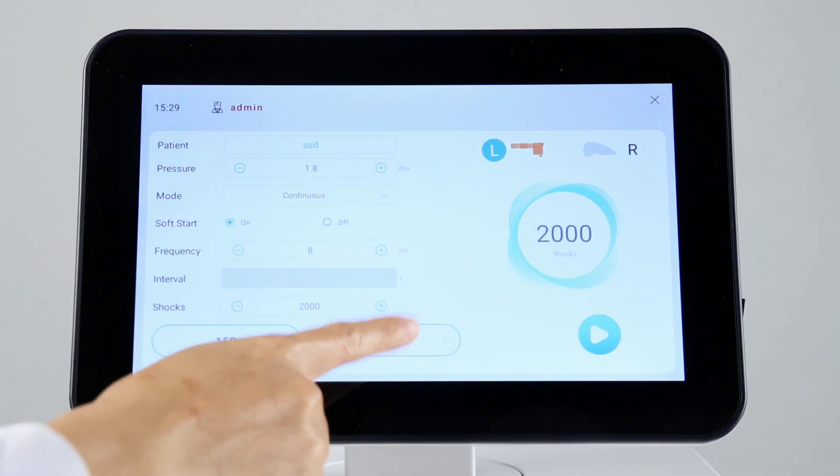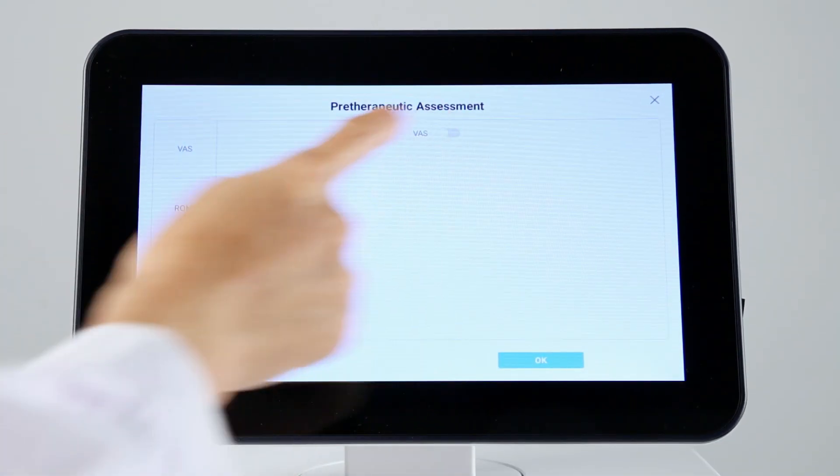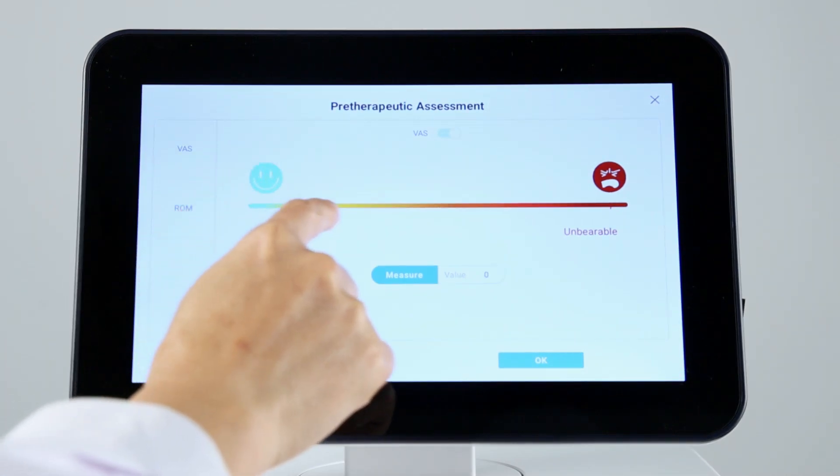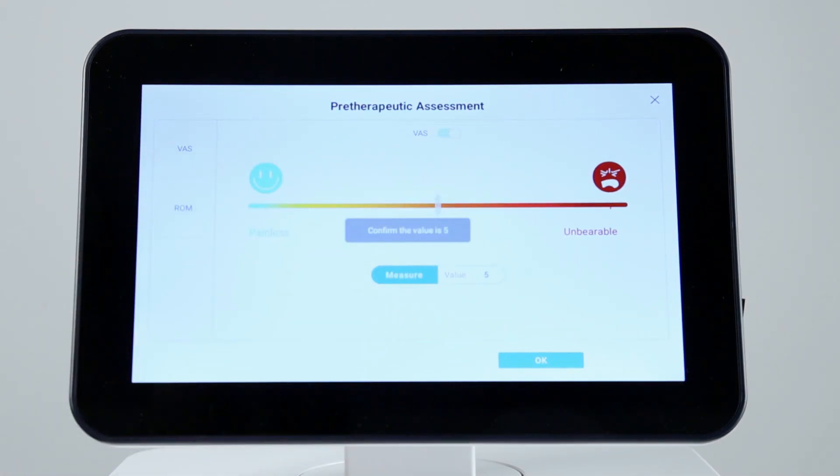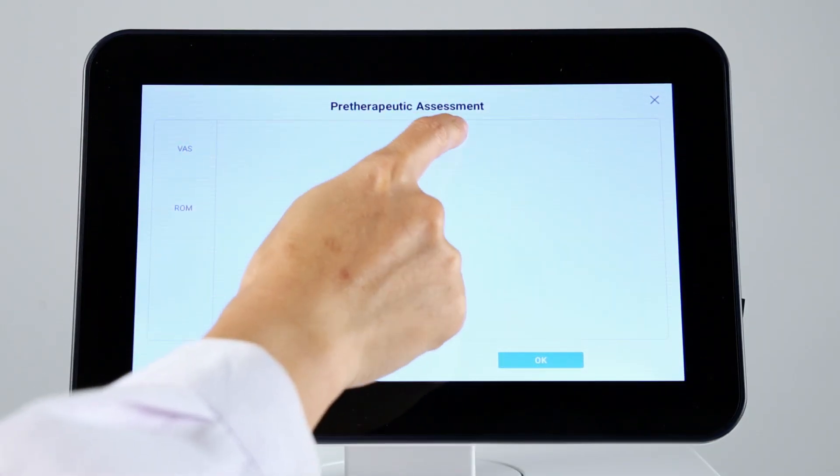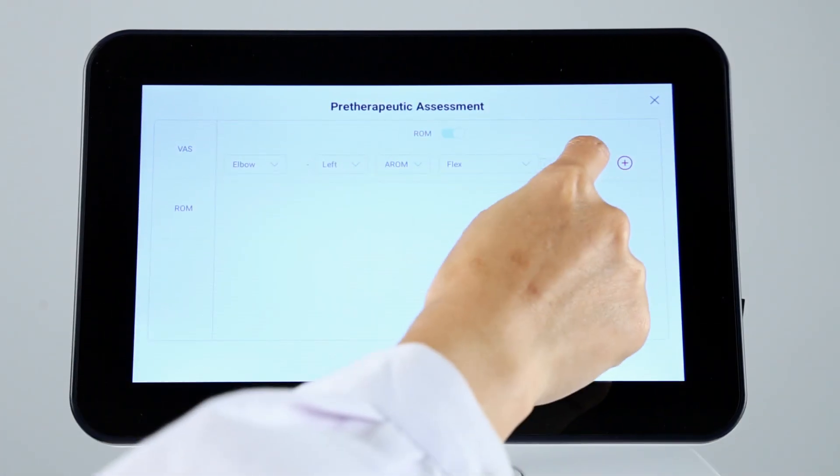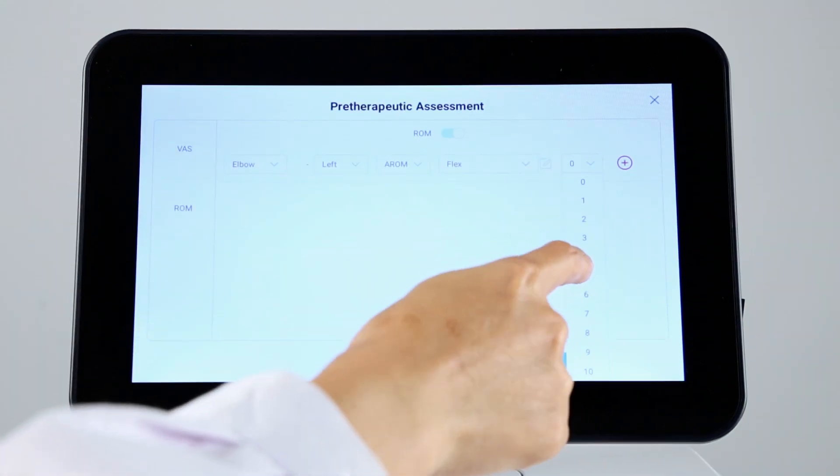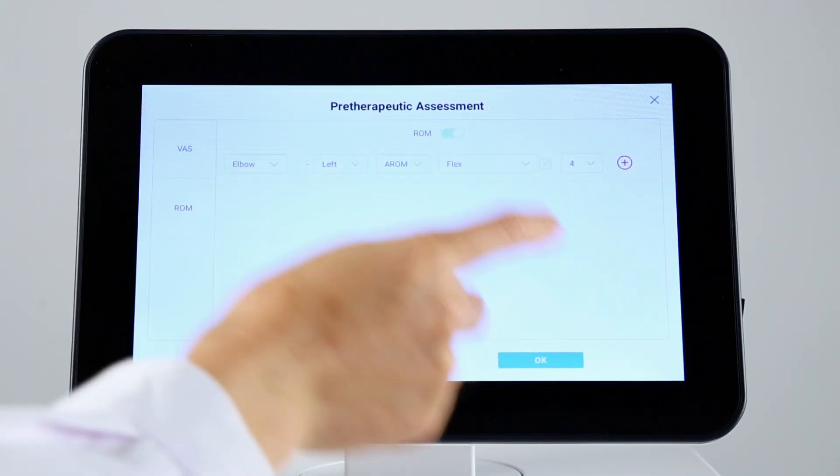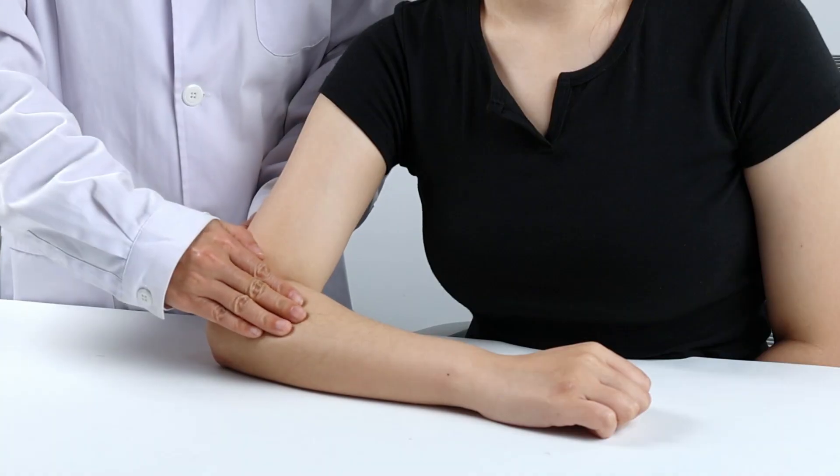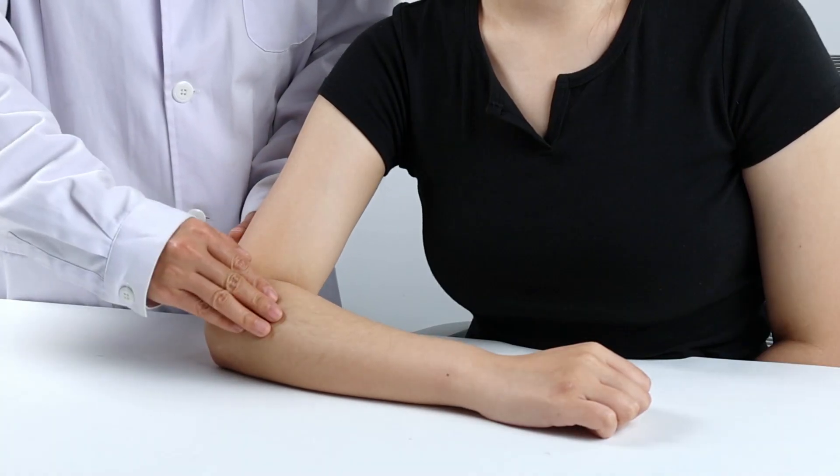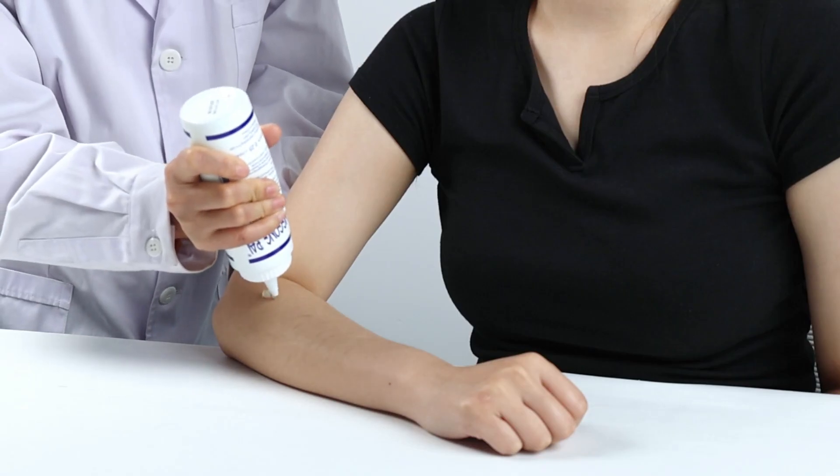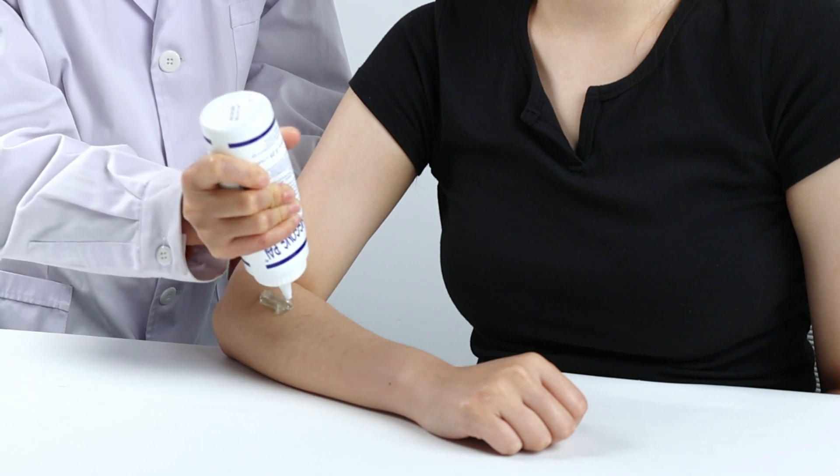Click evaluate button. You can evaluate the pre-treatment pain and mobility conditions of patient for comparison after finishing the treatment session. Before clicking the start button, locate painful spots using palpation. Then apply a generous amount of gel to the treated area.